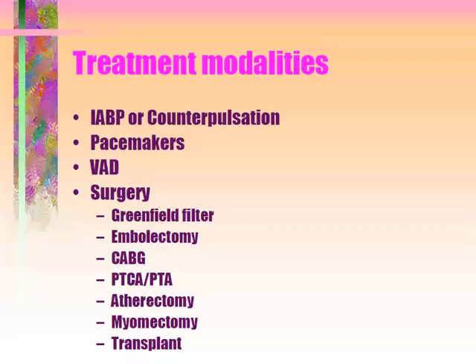Pacemakers can be temporary, and if they're temporary, they can be external, transvenous, or transthoracic. They can be permanent, where they're either transvenous or epicardial. They can be combined with an implantable cardioverter defibrillator, but overall pacemakers are used to maintain a base heart rate. That's all that it's done. It just maintains a base heart rate.